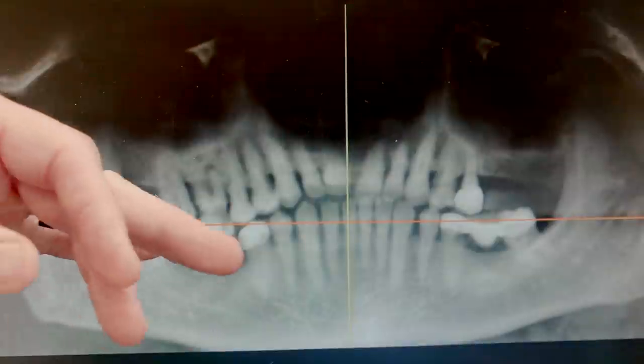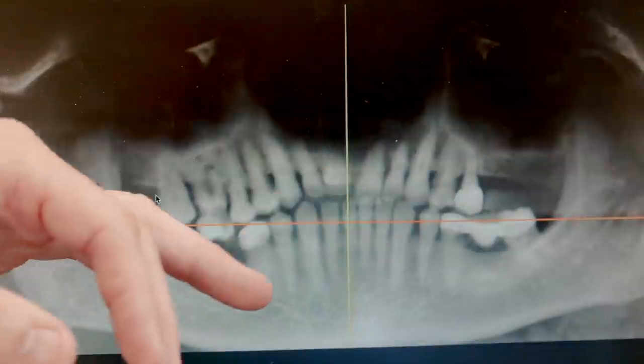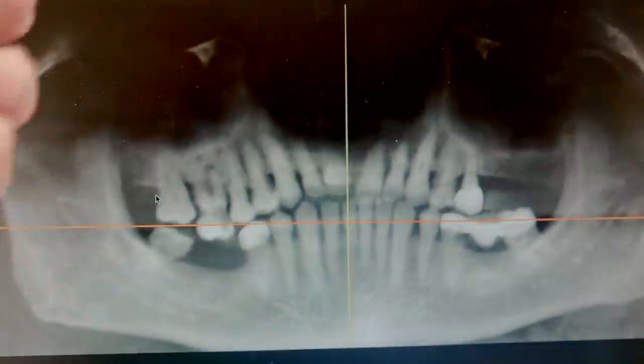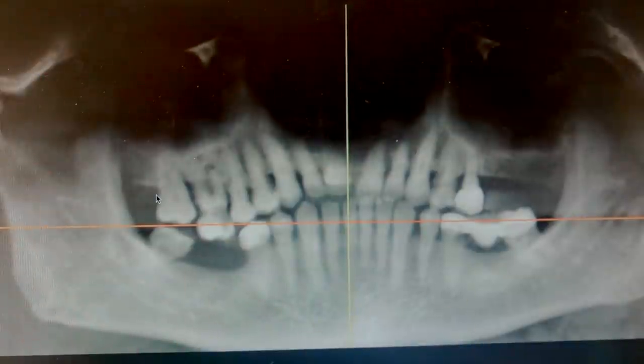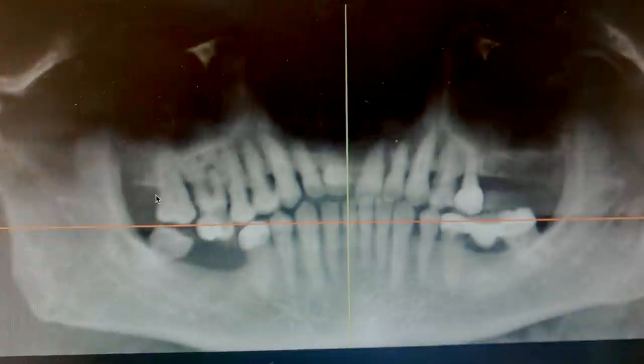In the preoperative X-ray there's just a lot going on — deep pockets, pus coming out of a lot of these areas, mobility, loose teeth, and broken teeth. This required an all-hands-on-deck approach where we had to address everything for this patient.